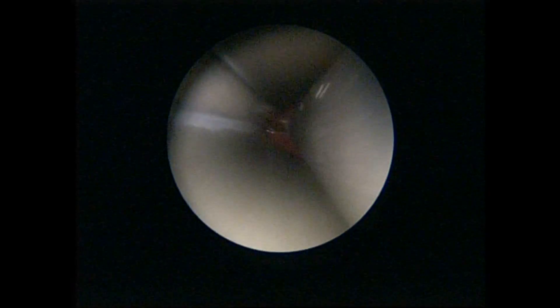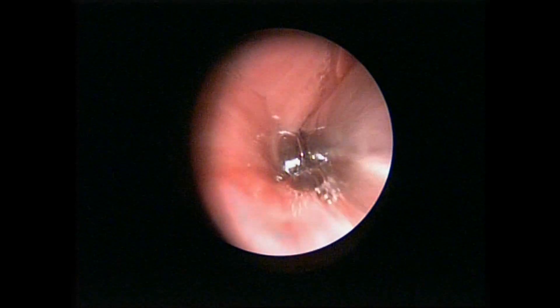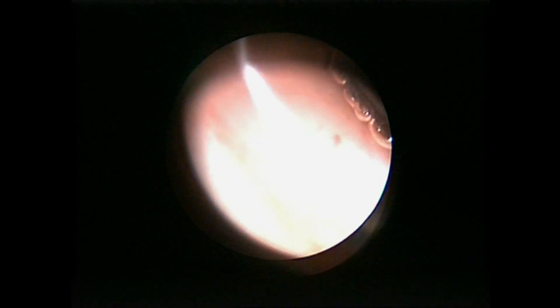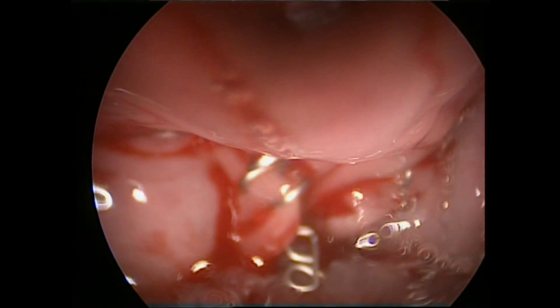One must follow the instructions given by the manufacturers of these staplers to avoid potential leakage. This step of the surgery can alternatively be done using a laser. In some cases, the endoscopic method cannot be done and an external cervical approach is required.